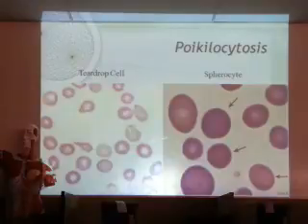And on the right side we have red cells that look really dark, but it's not because they have more hemoglobin. It's dark because the central pale area is not there anymore. A central pale area means you have a biconcave shape, the flattened shape. If you don't have a central pale area, that means the cell is more spherical. So we call these spherocytes. Although they're dark, we don't say hyperchromic. We just say spherocytic. Spherocytes.